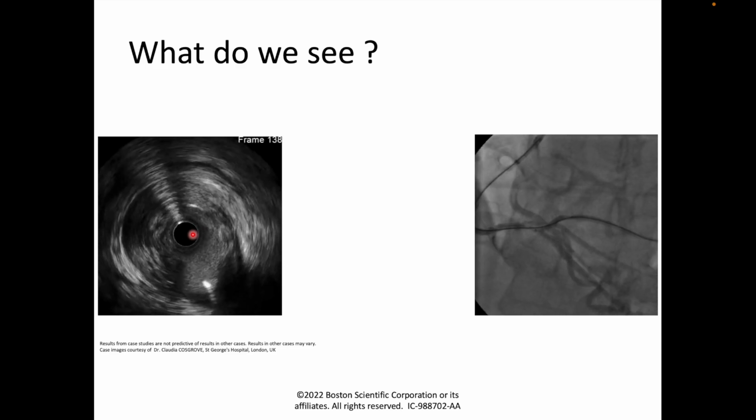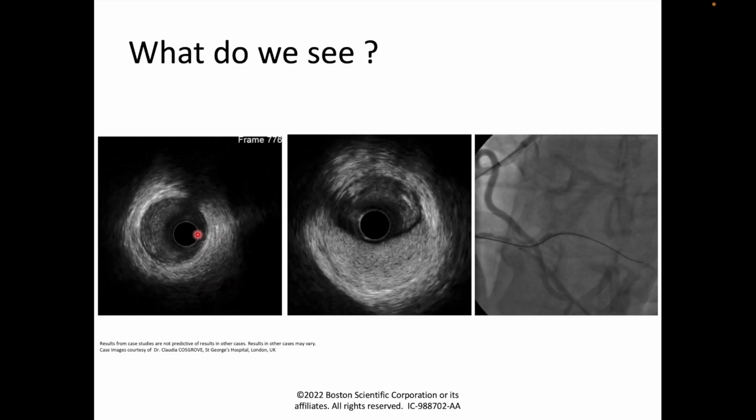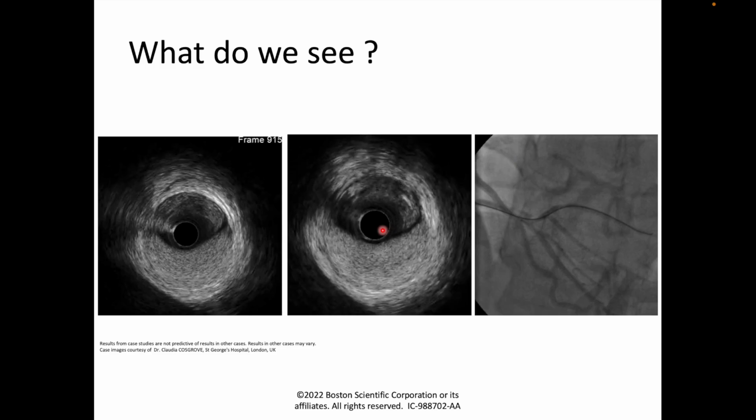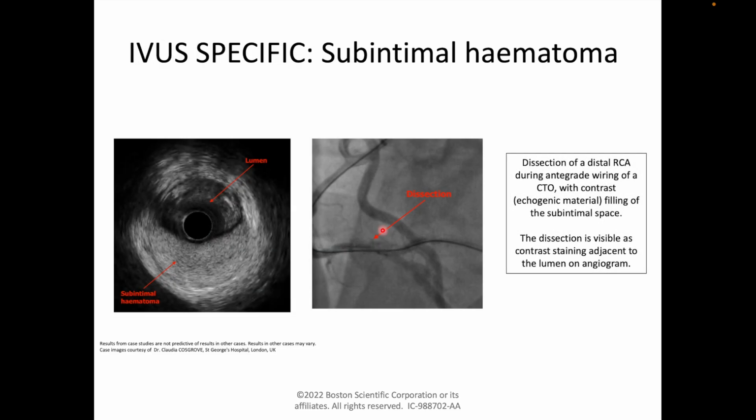So if I show you the still image of this, maybe it's easier for you to identify things. So let me show you the labeling. That's the IVUS catheter, that's the lumen, you can see the intima there, and then that's the media layer, which probably seems like coming like this, and then there is also an impression of media going like this. And all of this material that you see here is actually a well organized hematoma. So this is a subintimal or intramural hematoma.